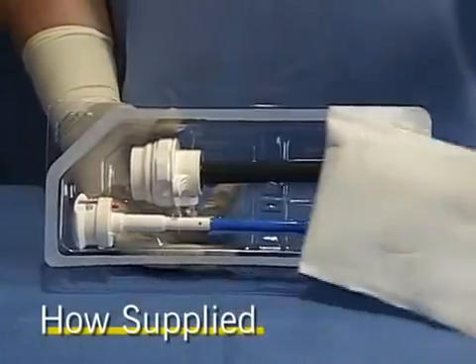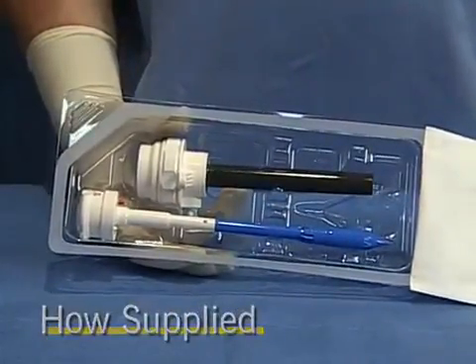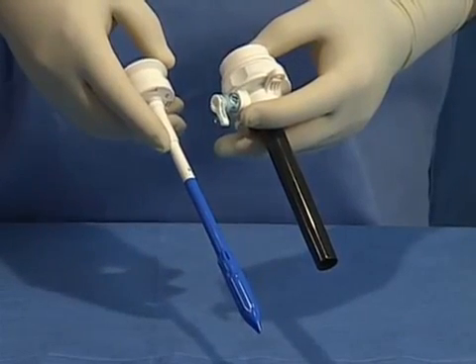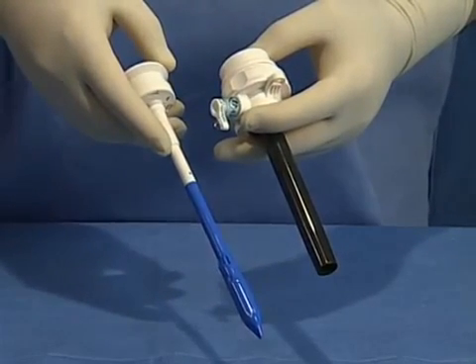The VersiPort Plus V2 Trocars are shipped sterile. The VersiPort Plus V2 Trocar consists of a bladed obturator and a housing and cannula assembly.